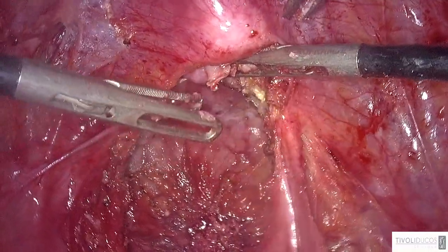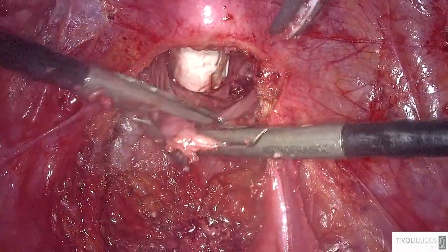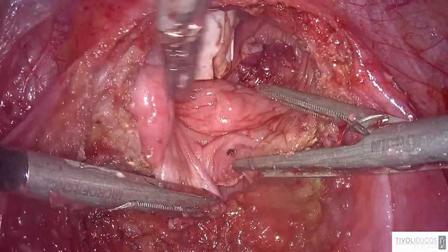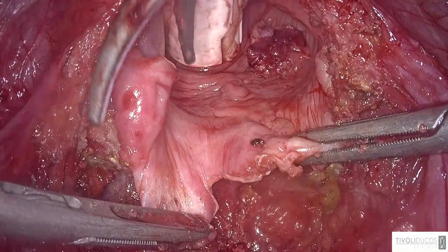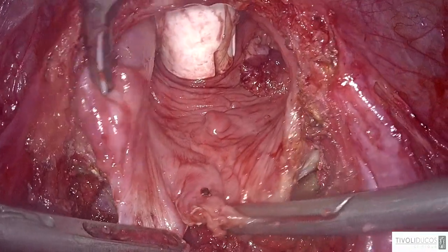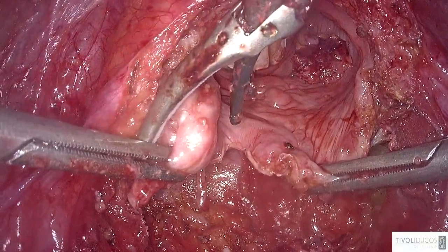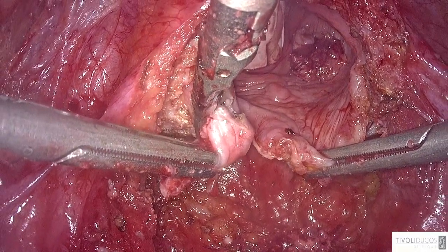Horace, could you show us the healthy border of the right and left side? Are you sure that you removed all the nodule in the healthy side? What is the appearance of the healthy tissue? Could you explain that to the audience, please? I touched before, so here is normal tissue. Here it is not. It's very strange to be a normal tissue, but I think it is normal. I wonder if it is the scar of the previous surgery.